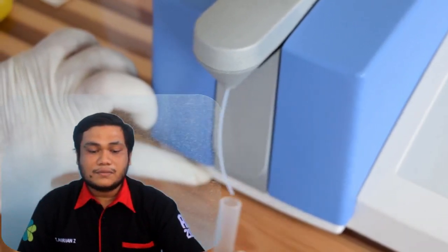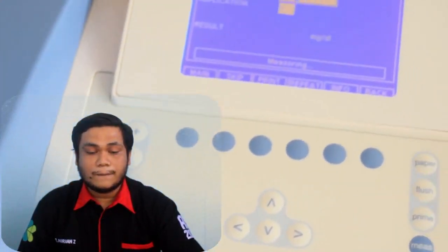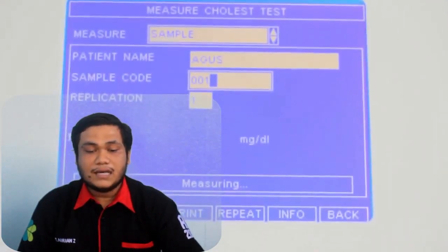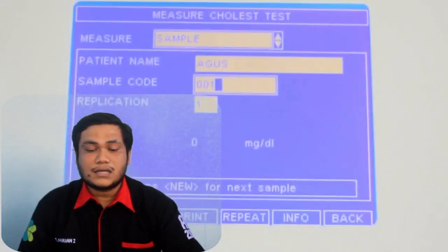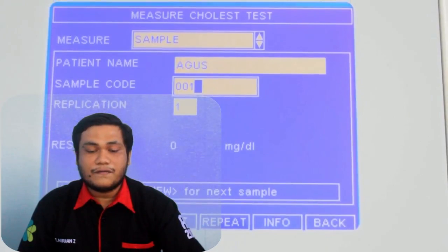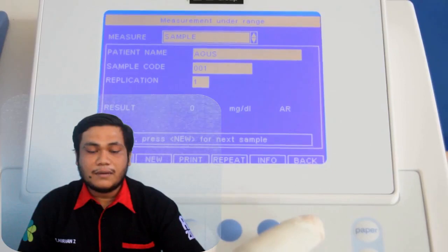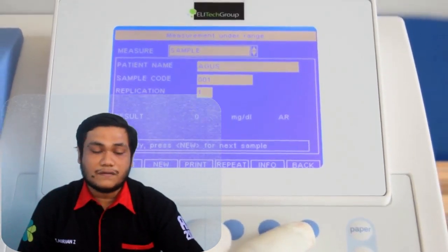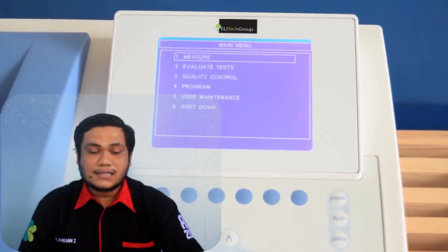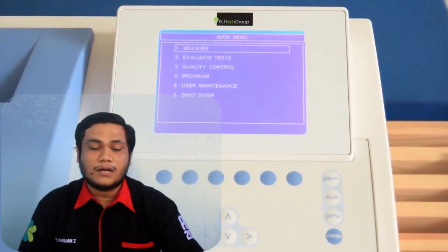Number 7. Insert a pin, a very small screwdriver, into the Y hole. And number 8. Press the on button on the soft key, and then the light will turn on very bright. Don't look into the light because it is very dangerous for your eyes. You can turn the light off by pressing the off button on the soft key. Then step number 9. Press the start button on the soft key to start adjusting the light. The following display will appear.